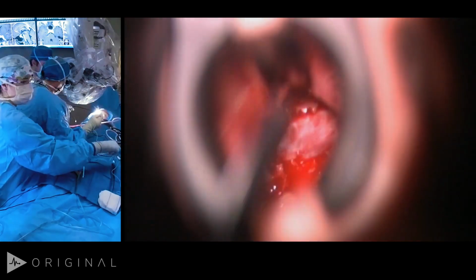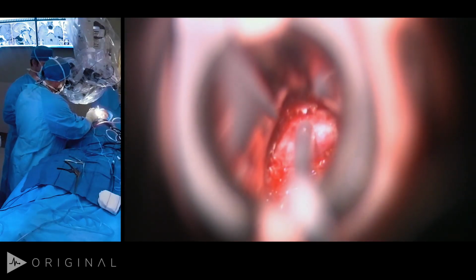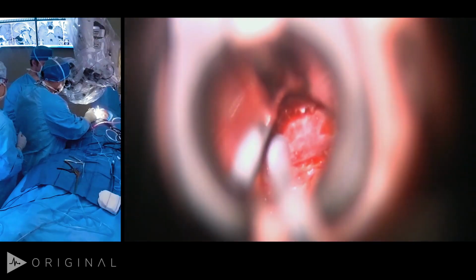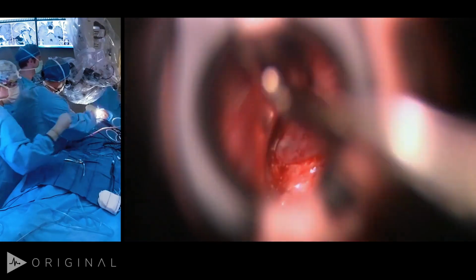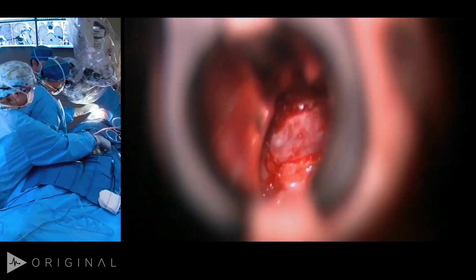I feel pretty comfortable where the midline is, and I'm not really worried about the carotid, but a very useful tool is this microdoppler. If you have any question, it's worth just listening for a moment to make sure you're not running into the carotid artery. So there's a safe entry zone. I can hear the carotid on the left, just barely, but right there will be just fine. So I would suggest that if you're unclear about the anatomy, stereotaxis is very helpful, stereotactic CT or MRI. And if you're in the surgery and you don't have that and you're worried, take a step back and just get a microdoppler and listen for a moment.